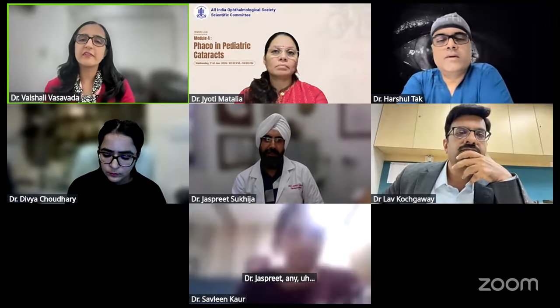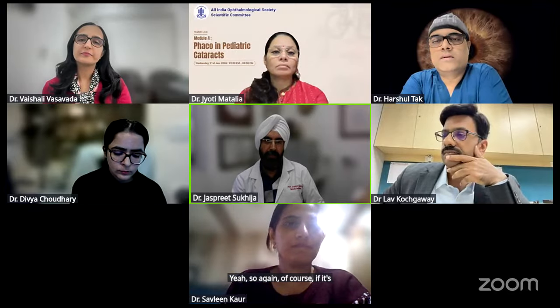Dr. Jaspreet, any tips on this? Yeah, so again, of course, if it's quite an angry looking PFV, I would really not put an IOL and be very skeptical about doing the surgery as well in these patients, depending upon all the ultrasound findings.